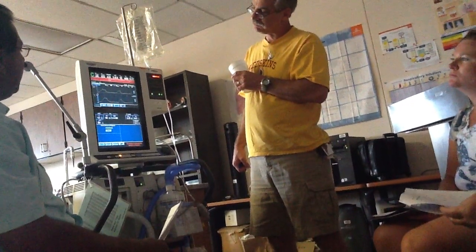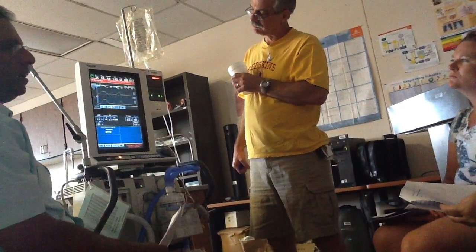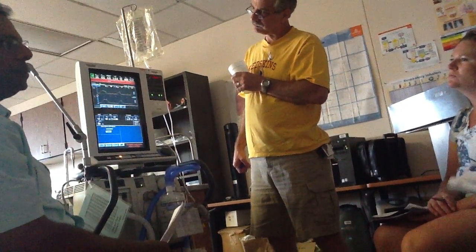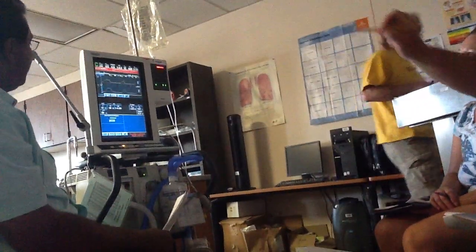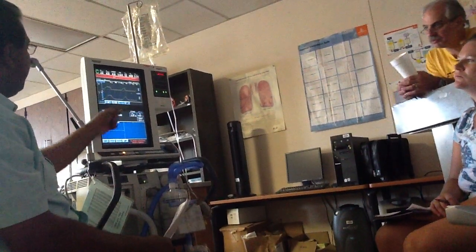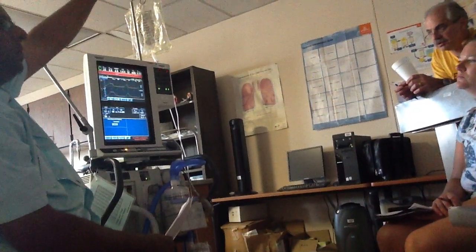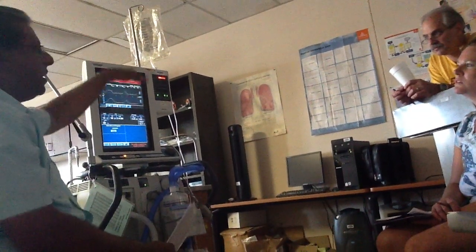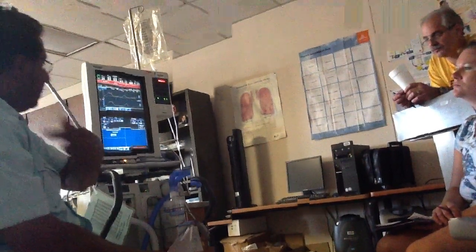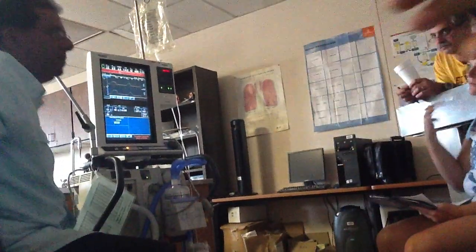So if I need to increase this guy's tidal volume to 600 or 700, what should I do? You could increase the pressure. You could increase the rate. When I increase the PI, this tidal volume will go up. When I decrease the PI, this tidal volume will come down. I showed you before on the board. Now that's how we can increase it with the machine.